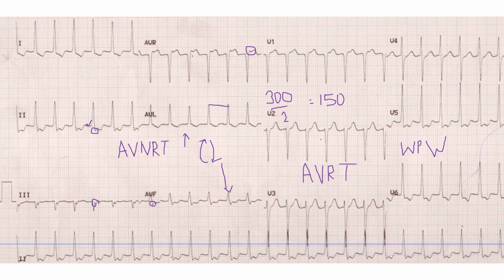We will discuss that also. When the ECG is in a young individual, it is very unlikely to be due to associated ischemia. But in an older person, ischemia should be ruled out later on, even though similar changes can occur even without ischemia.